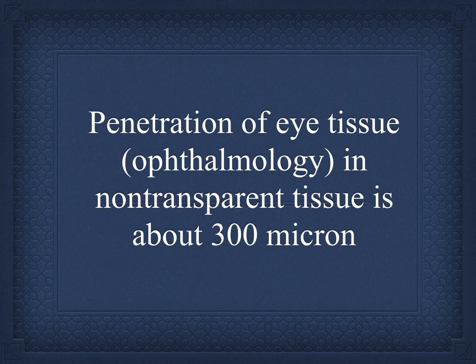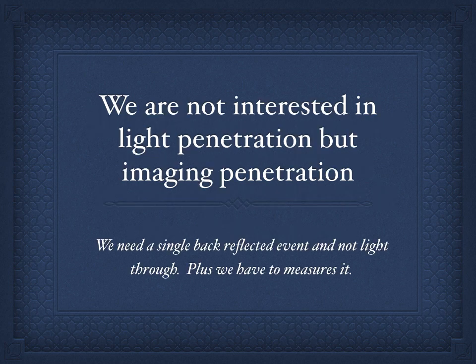This was the state of the field when I entered it. You can understand why there was so much skepticism and few people worked in it. And if imaging was not successful in non-transparent tissue, which was achieved roughly between 1993 and 96, then I don't know how much widespread interest in the technology there would be, or technological advances. For instance, the cardiology application drove a lot of technology advances that ultimately would be used in ophthalmology. So the non-transparent tissue work pushed the ophthalmology work, but in fairness, a lot from the ophthalmology work was used for non-transparent tissue.